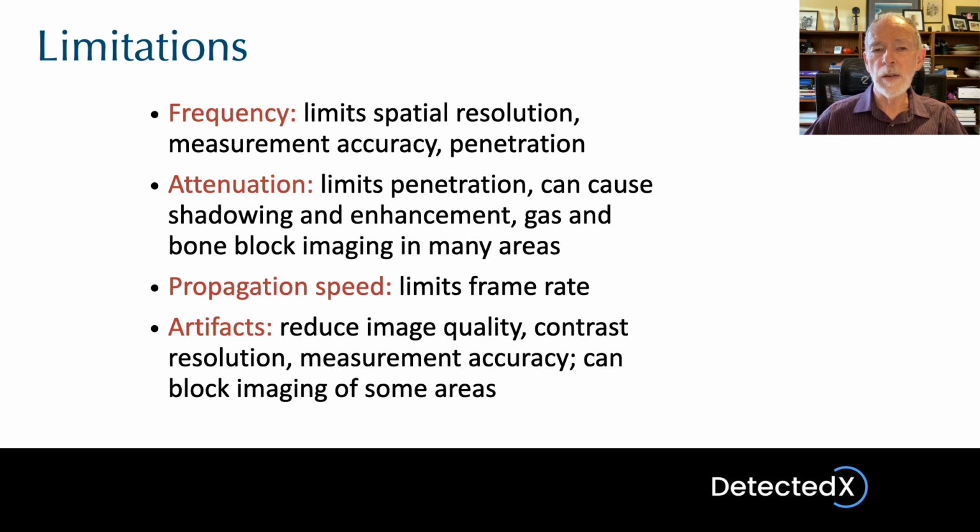So basically, we have a conflict between penetration and resolution. To improve the penetration, we need lower frequencies. To improve the resolution, we need higher frequencies. And so always the frequency you use will be the best compromise between the penetration and getting the best resolution possible.